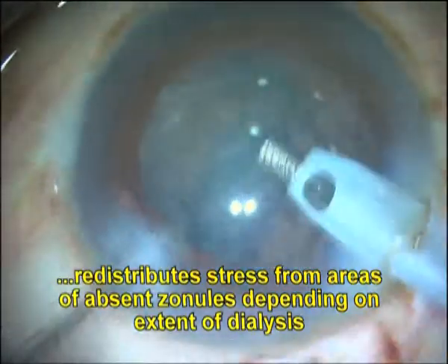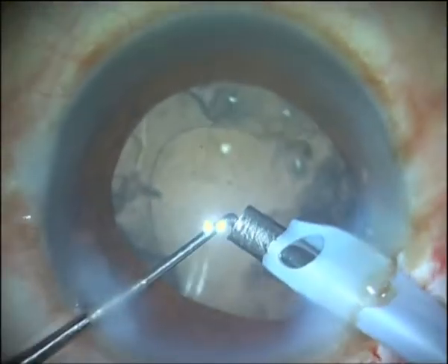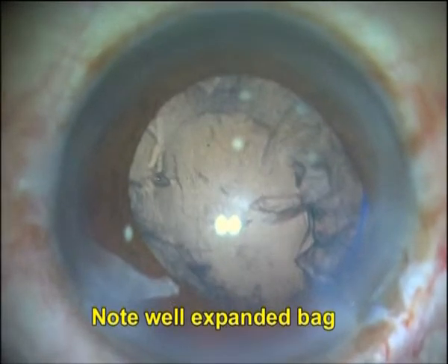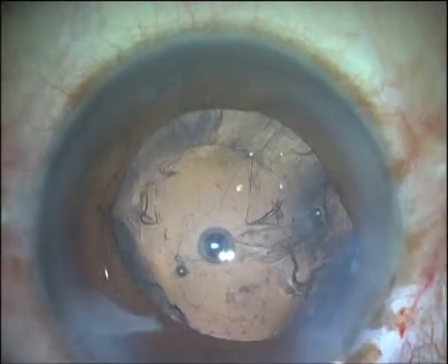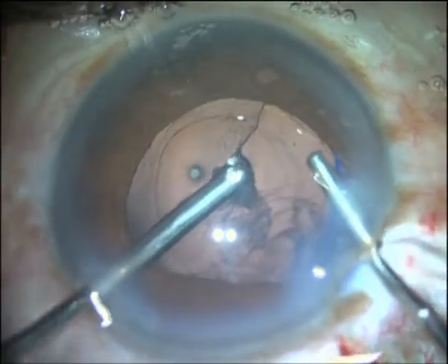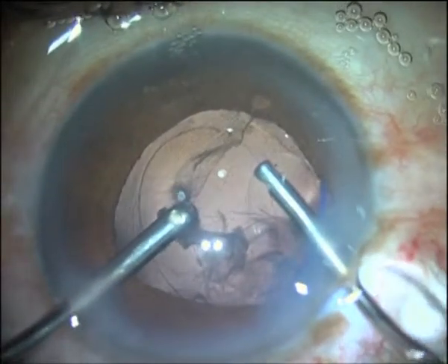By being a hemi-ring in extent, it provides better expansion of the fornix and decreased chances of fornicial or capsular bag aspiration into the phaco tip, while at the same time decreasing the chances of vitreous prolapse through the area of dialysis. It thus gives both horizontal and vertical stability as well as decreases the flaccidity of the posterior capsule, despite being a segment and not a complete ring.